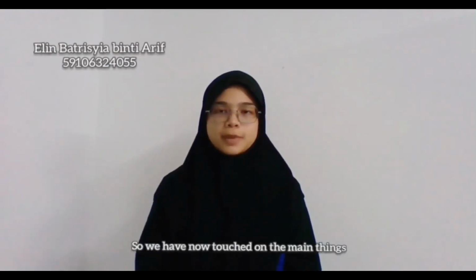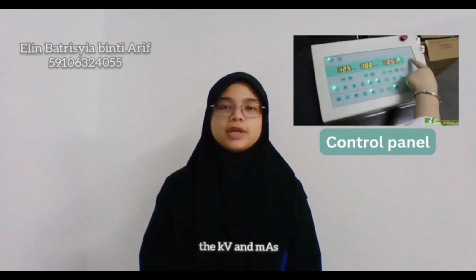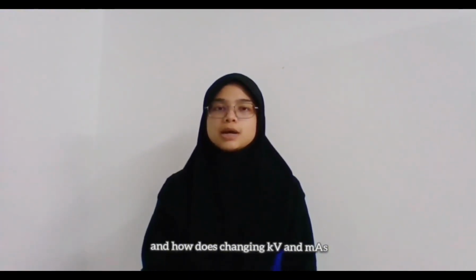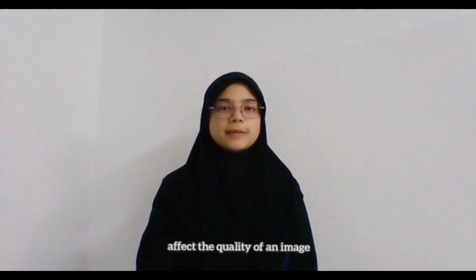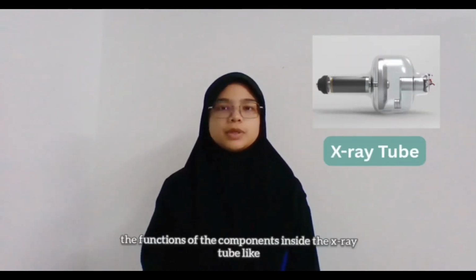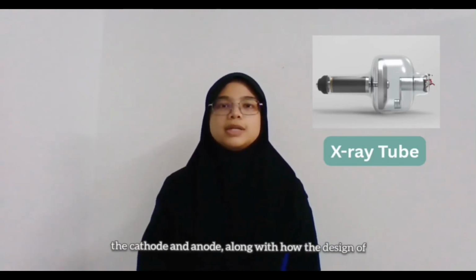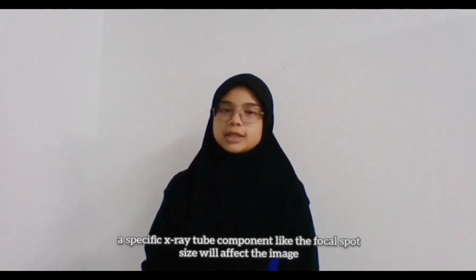So we have now touched on the main things like the control panels, which is where radiographers control kV and mAs, along with what symbols and icons do, and how changing kV and mAs affects the quality of an image. And then we've touched on the X-ray tubes, the functions of the components inside the X-ray tube, like the cathode and anode, along with how the design of X-ray tube components, like the focal spot size, will affect the image.